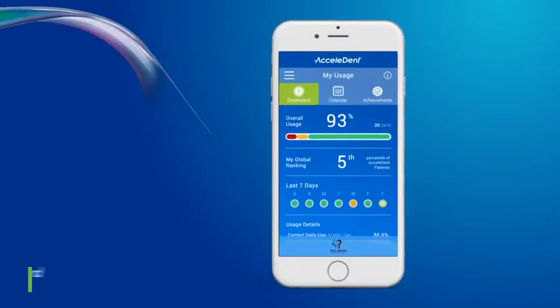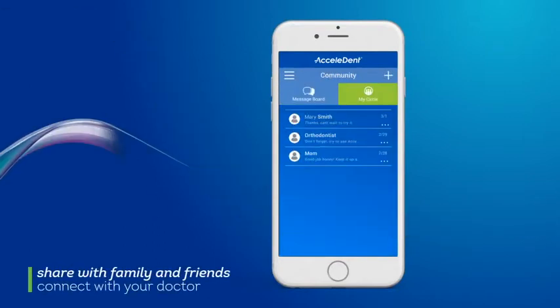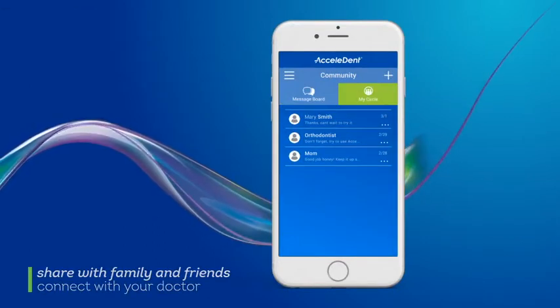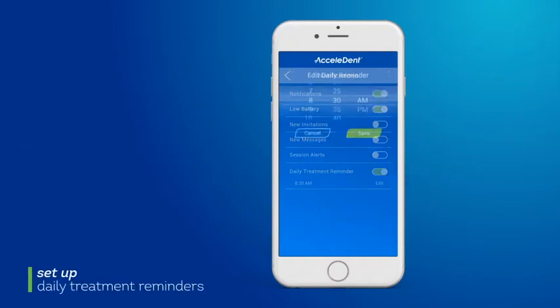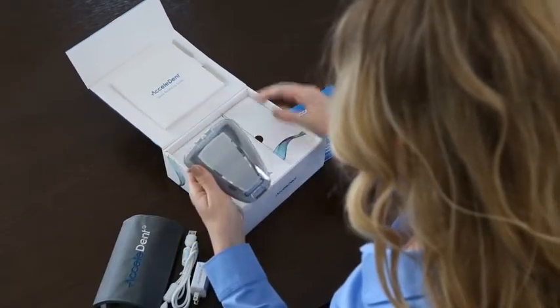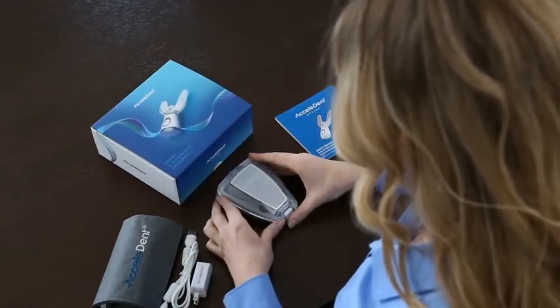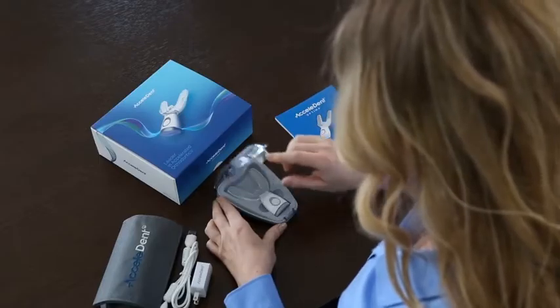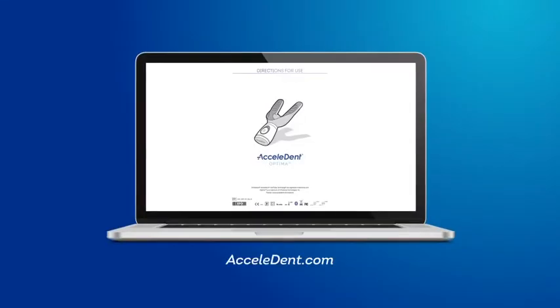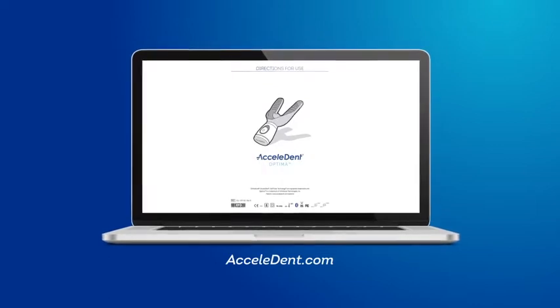Use the Accelident app to check your dashboard for achievement progress, share with family and friends, connect with your doctor for important information, and set up daily treatment reminders. This video will cover everything you need to get started with Accelident, including the components of the system, step-by-step instructions, and an overview of the app. Detailed instructions are also available in our directions for use guide located at Accelident.com.